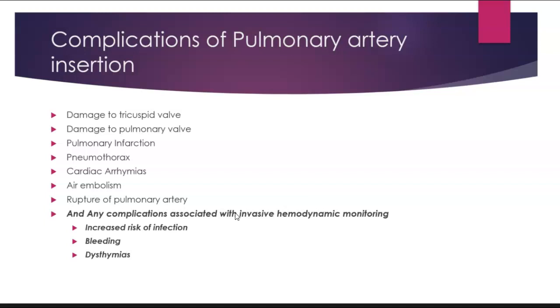As I inflate that balloon, I can have something called a pulmonary infarction, meaning that infarction means a lack of blood flow. As I inflate that balloon in the pulmonary artery to get that wedge pressure that reflects the function of the left side of the heart, I am essentially stopping the blood flow to that tissue of the lungs, and then I can cause some tissue damage and infarction to that area. So I don't want to have that balloon inflated for longer than 10 seconds because I don't want any damage from lack of blood flow.